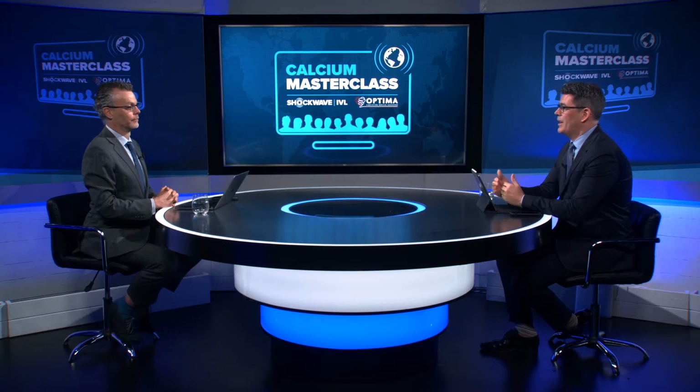But the second reason was to introduce the concept of optimized PCI into the treatment of calcified lesions. So in the OCT substudy, we were really implementing all that we'd learned from non-calcified lesions about optimizing stent expansion. And so all the rules that we've learned from, for example, the Illumien studies about sizing the vessel using the external elastic lamina, looking at the distribution of calcium along the length of the lesion and where we need to direct our calcium modification. All those factors were brought to bear on the optimization part of the imaging substudy. So firstly, you showed the mechanism of action, and secondly, it was about delivering optimized PCI.